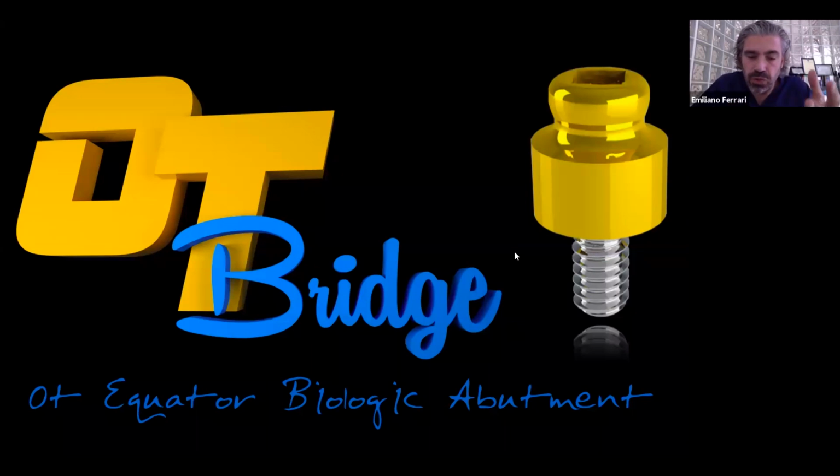You can just work in the lab to personalize a little bit the color, the design, the ridge, but they use commercial teeth. So you may have a removable denture. Removable sometimes means poor economical and not really high aesthetical, but in this case, I'm sure that the patient is very, very happy and satisfied about that. So there are 3 different ways to use those kinds of attachment for removable.